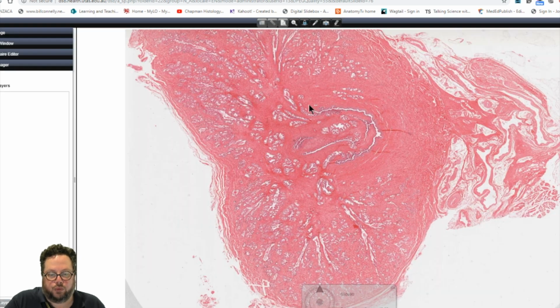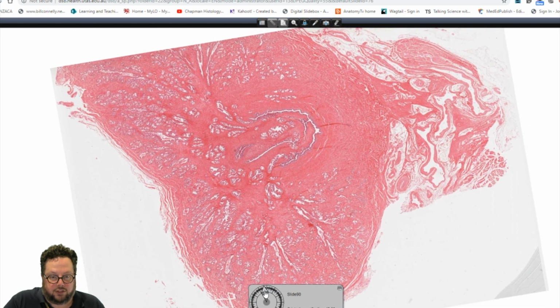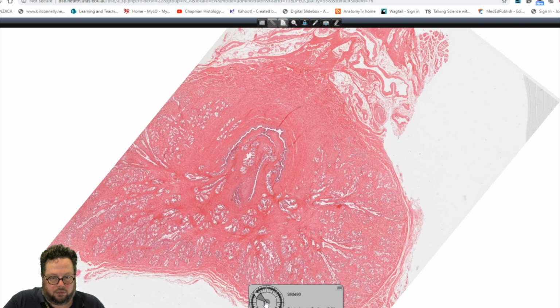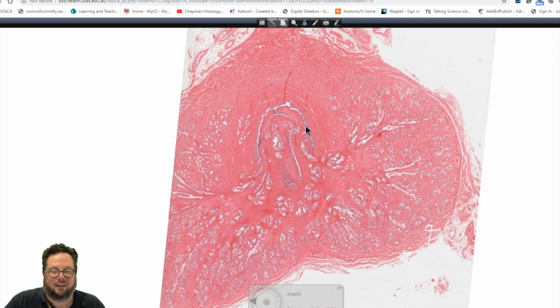When it finally loads, here we go. So what I'm going to do, I'm just going to rotate it around so everyone hold their lunches in their tummies. Oh, yeah. Hang on, not there. Close enough.